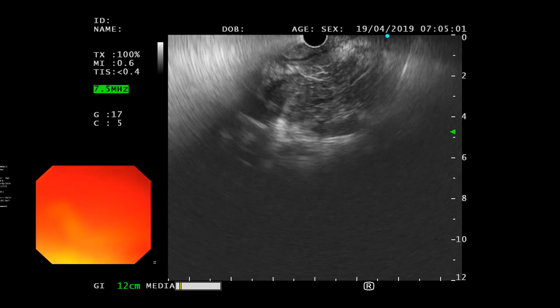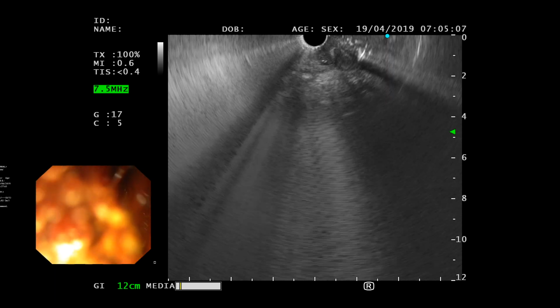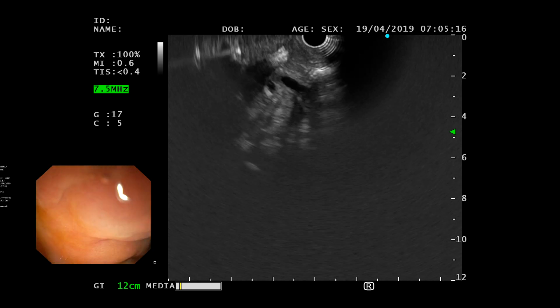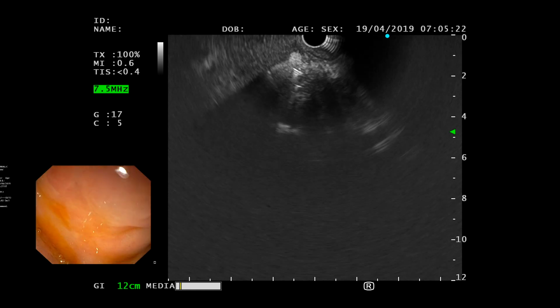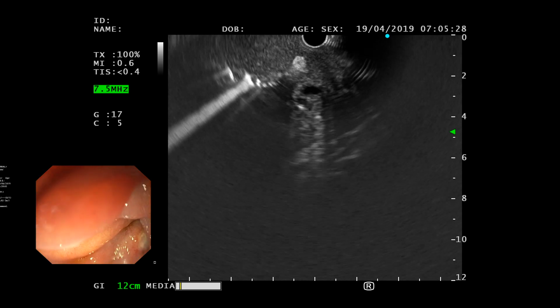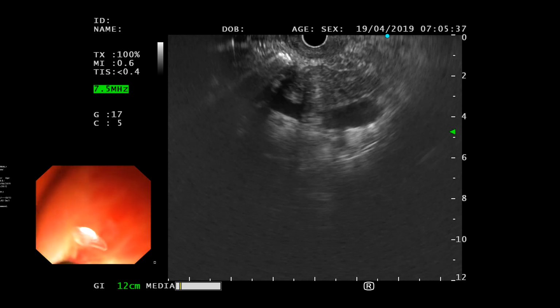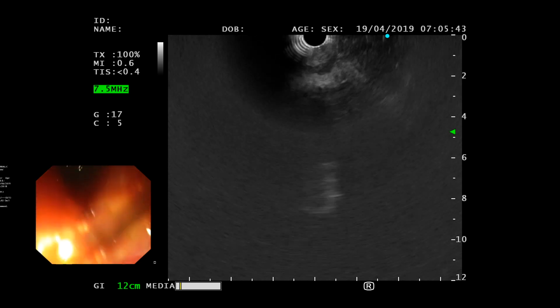We are done. आगे नहीं चलो, D2 में? D2 में? जाओ. तो कोई बात नहीं, चल जाओगे. यहाँ CBD आप में जा सकते हो, तो अब क्यों नहीं जा सकते? इशू क्या है? मतलब you have to follow the anatomy and that's it. नहीं, ये disease लगता है. We have got the problem here. ये ulceration से लगता है, ट्यूमर इन्फिल्ट्रेशन. हाँ, ट्यूमर इन्फिल्ट्रेशन. तो अवॉइड ही करें फिर, ये तो रिस्क होगा. हाँ, we have to avoid है ना? चलो निकाल लो.